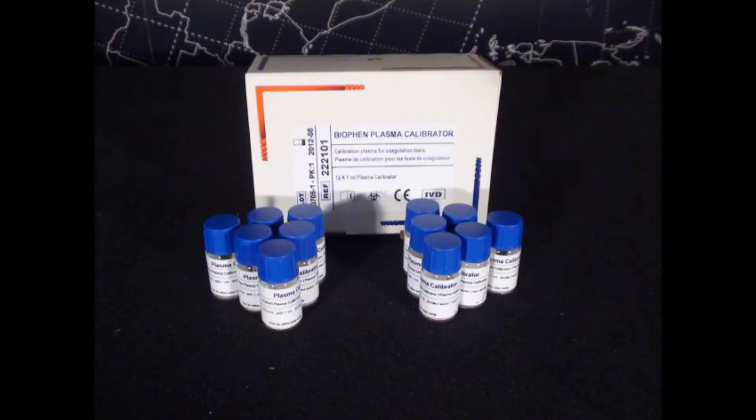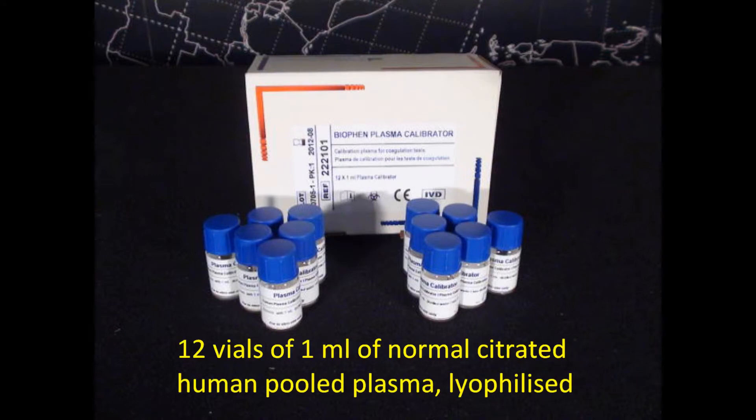Biophen Plasma Calibrator is normal citrated human plasma used as a calibrator in the assay methods for some coagulation factors. The reagents supplied include 12 vials of 1 mL of normal citrated human pooled plasma, lyophilized.